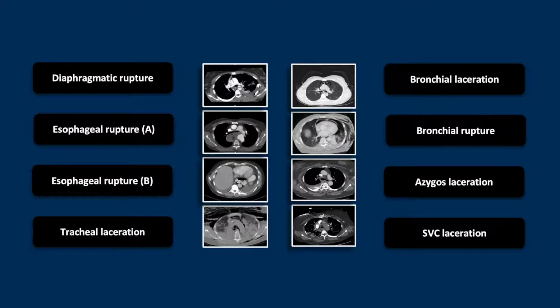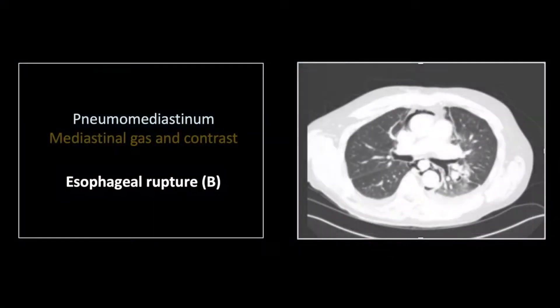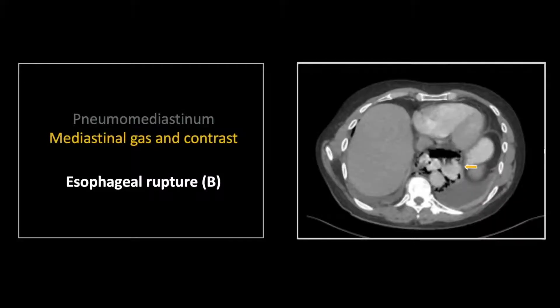Our next case is also an esophageal rupture. This one did result in an extensive pneumomediastinum, which you see here on the lung windows. There is a collection of mediastinal gas and contrast, relatively well circumscribed, in the inferior mediastinum. There is a nice view of the actual defect in the left distal aspect of the esophagus.